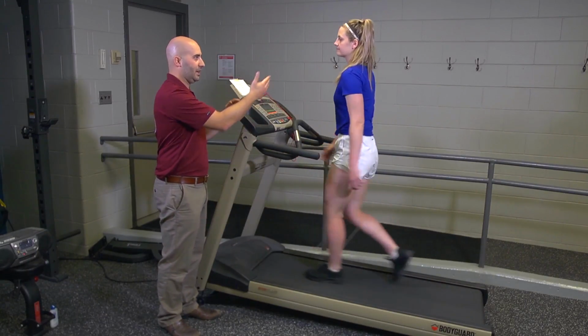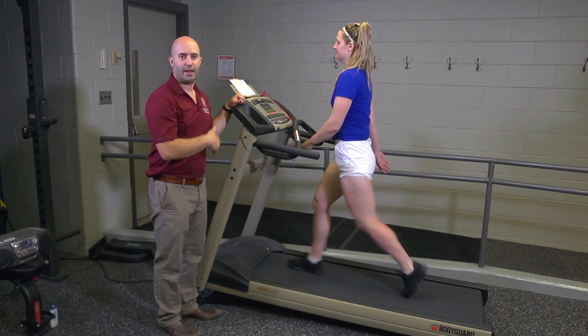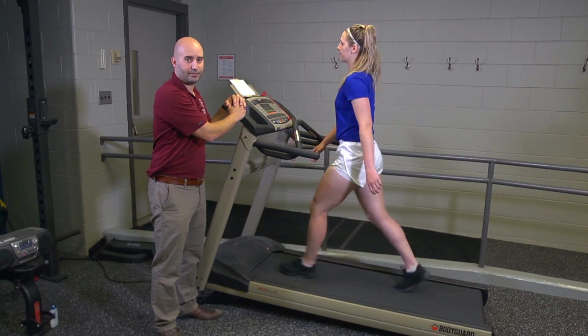I'm in a great position to see how she feels, how she's looking. I let her know that she can stop. Clara, you're doing good. She's feeling great. And I would just do this for another 4 minutes. After that, we would move on to the cool down recovery process.